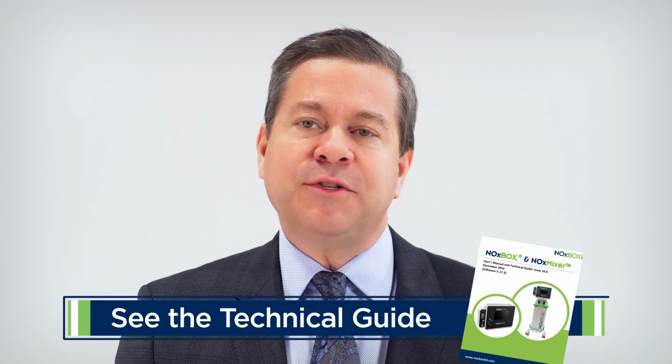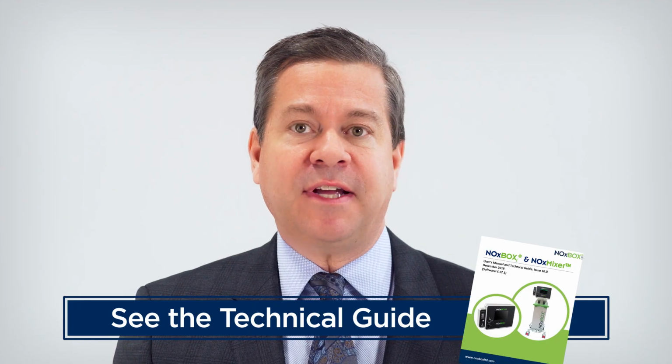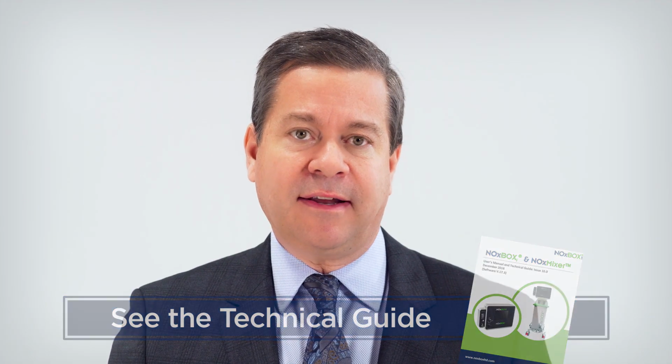It's important to remember that compressed gas cylinders can be extremely hazardous when misused or abused and can present a variety of hazards due to their pressure and/or content. Before using NOxVent nitric oxide gas for inhalation and the NOxBOXi system, please read and understand the full list of safety precautions found in the technical guide. Here are just a few compressed gas handling reminders and precautions.